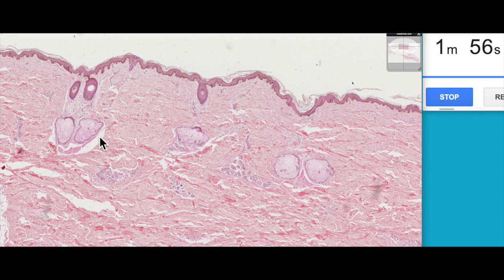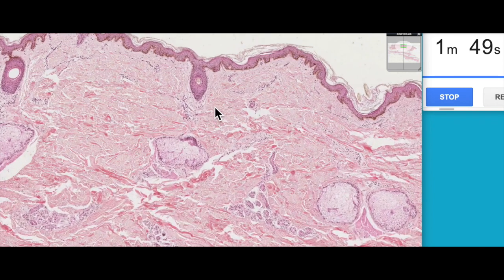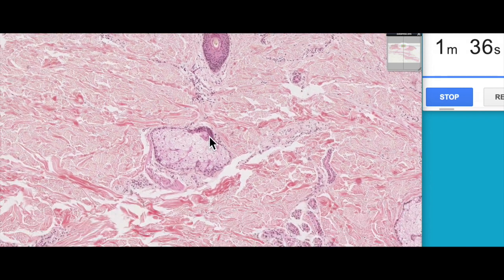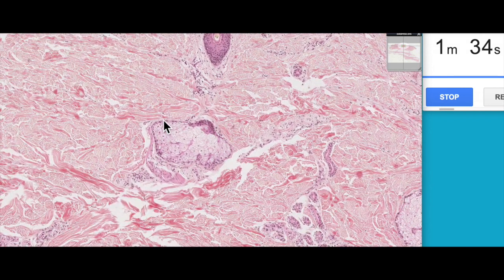The pilosebaceous apparatus includes the hair follicle, sebaceous glands, and the erector pili muscle. These hair follicles are actually downgrowths of the epidermis, and you can see the connection of the stratum basale here to this glancing section through the hair follicle — we haven't gone all the way through it, just done a glancing section.